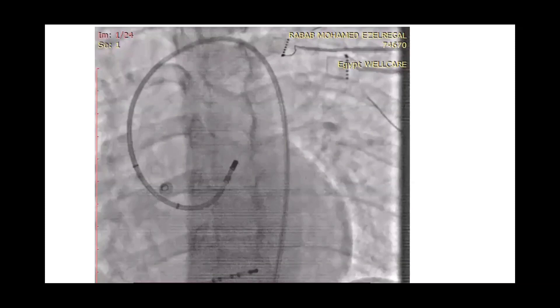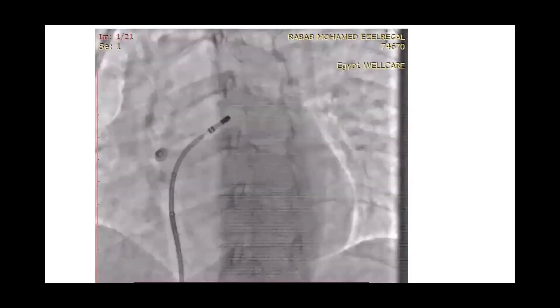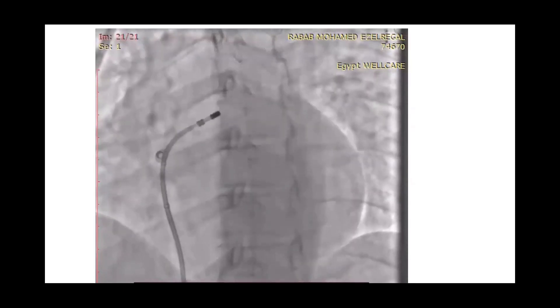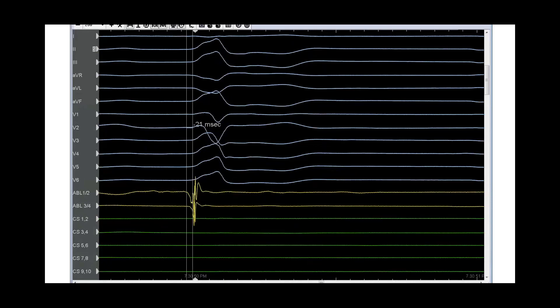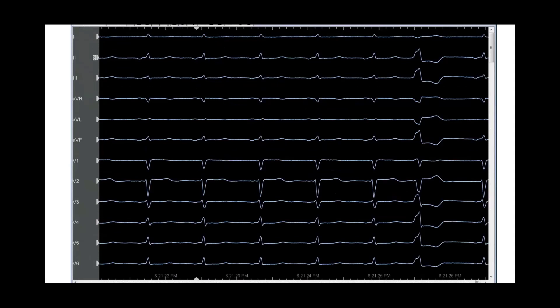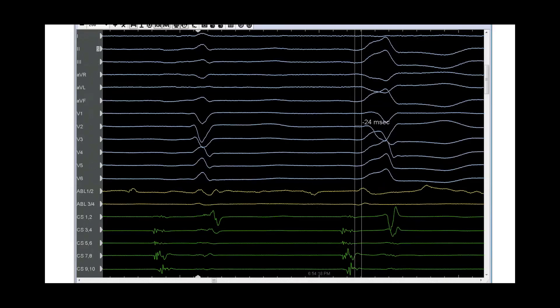At this point I'm showing the conventional fluoroscopy alongside the CARTO map. In our Ain Shams school we always rely on the recording and use it carefully, using it hand-in-hand with the 3D electro-anatomical mapping. With further mapping of the LVOT and then returning to the RVOT, we improved significantly — reaching minus 21 milliseconds local activation time preceding the clinical PVC. At that site we performed ablation, which was initially followed by recurrence of the PVC, so we sought a better mapping location.